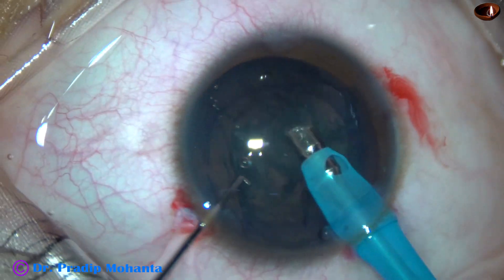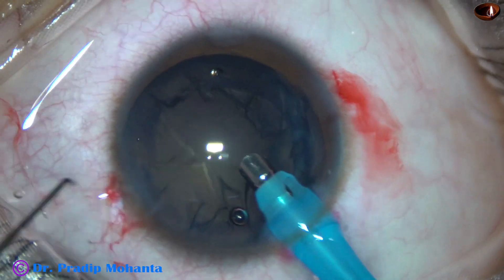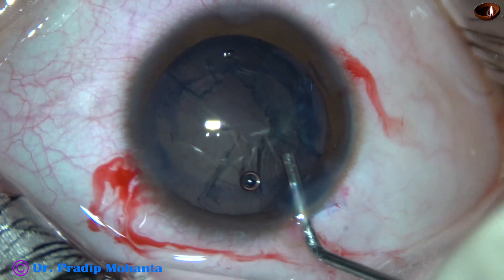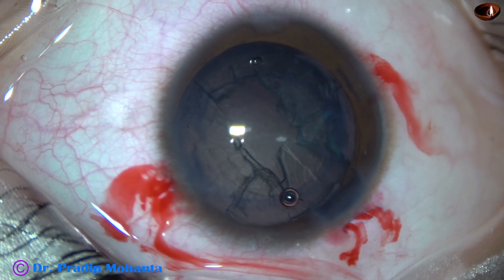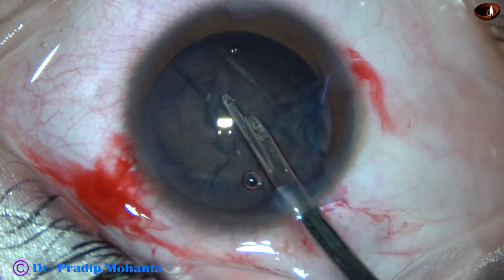You can balance the centripetal force of the forceps with the centrifugal force of the capsule. Now I am using only vacuum here to remove the lens mass — this may be called phacoaspiration. Some visco is used to fill the anterior chamber, and then I am using a 23G Simcoe to remove the cortical lens matter.